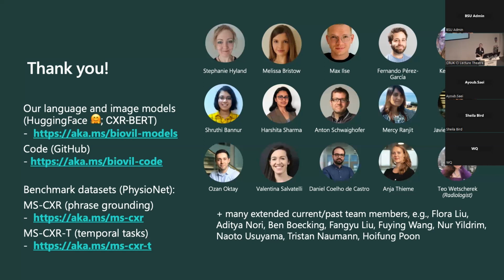Yeah, so to answer your first question about the ICU and the quality, yes, it is. The MIMIC team, very commendable that they have shared this data. This is a consistent challenge that we have, that we're trying to work with a very messy data set. Because these patients have so many repeat chest x-rays, sometimes the report doesn't mention things which would have been mentioned in a prior report. So we have this kind of missingness thing. Yes, indeed, the technical quality is sometimes commented upon, and now that we're trying to generate the findings section, they will sometimes say patient is rotated or motion artifacts, that kind of thing. So in theory, that information is in there.